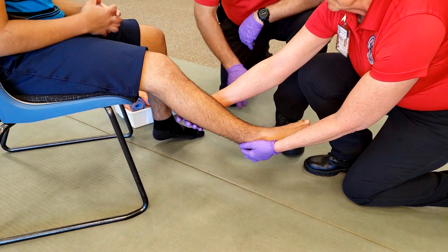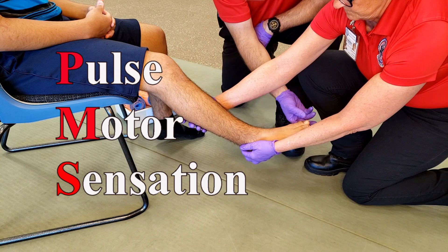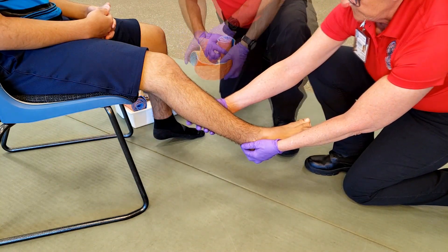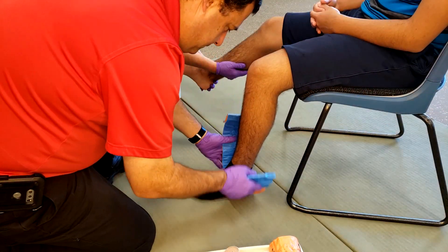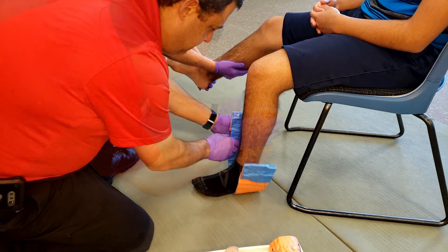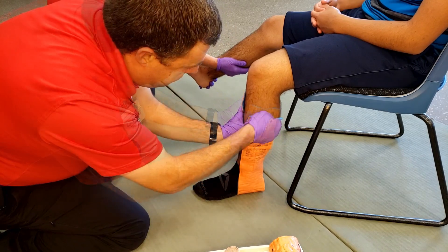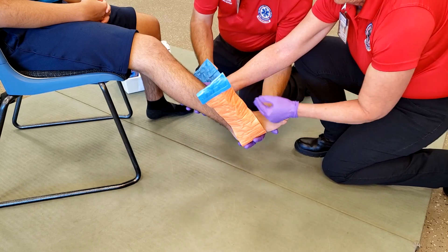Have your partner maintain manual stabilization while you check for pulse, motor, and sensation. Access the SAM splint and then use the uninjured leg to measure the device. While sizing the SAM splint on the uninjured leg, pay close attention so the SAM splint conforms to the patient's leg before moving it to the injured side.